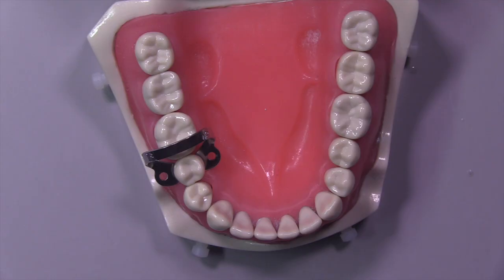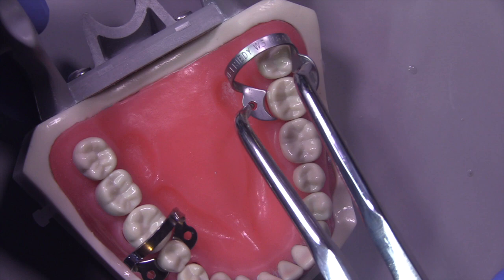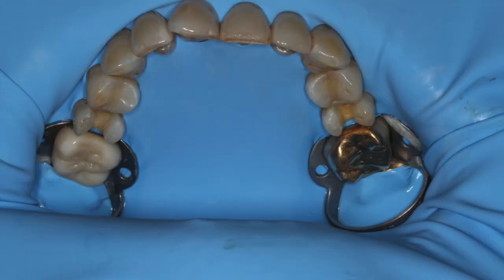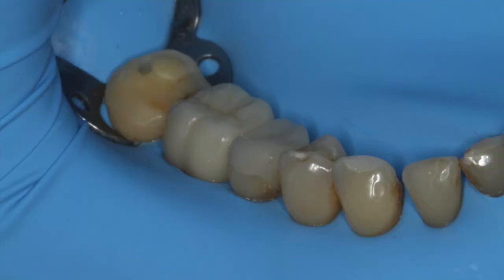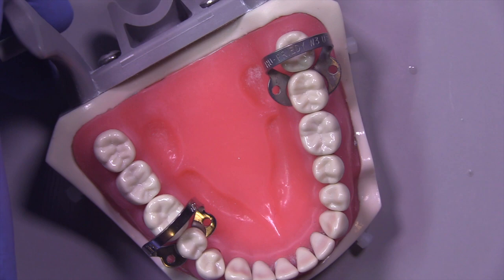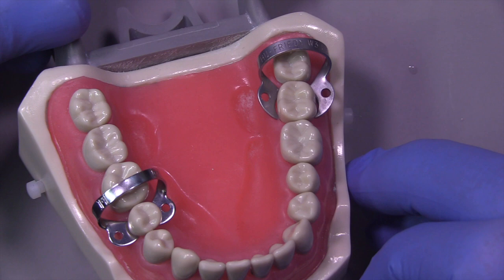Let's take a look at a few more clamps and see how they look. The next one I would use would be this W3 here. You can see that we insert it on the lingual first, getting the lingual to engage and then rotate towards the facial. Lingual first, rotate towards the facial — make sure we're not pinching the tissue and that the clamp is apical to the height of contour, four points of contact, adequate tension. And of course it has those flat wings that aren't going to festoon apically, causing discomfort and potential damage to the tissue.